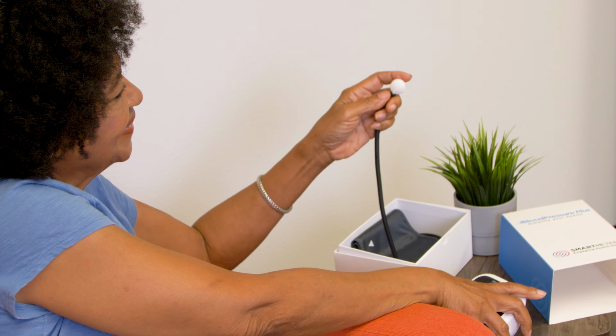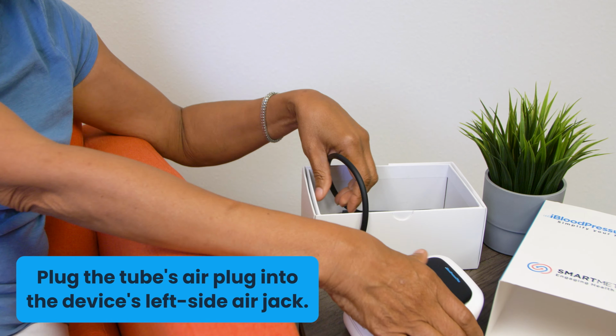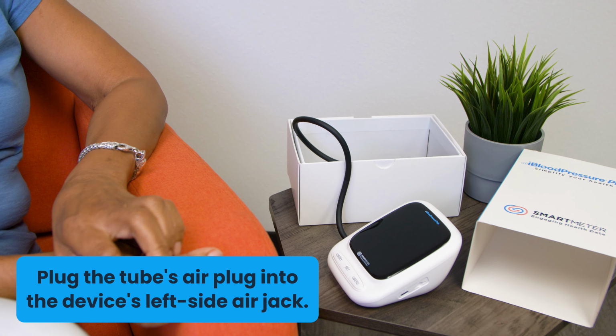To set up your device, firmly insert the air plug on the end of the tube connected to the arm cuff into the air jack found on the left side of your device.